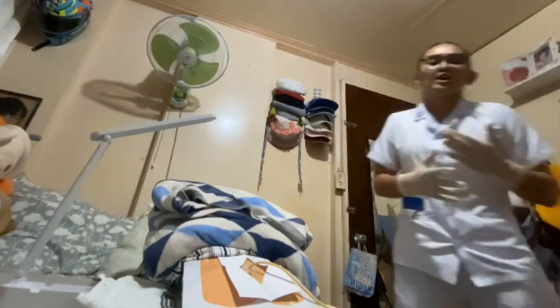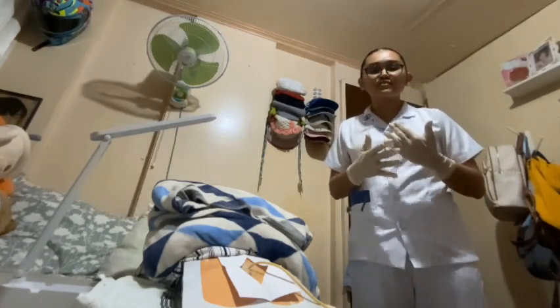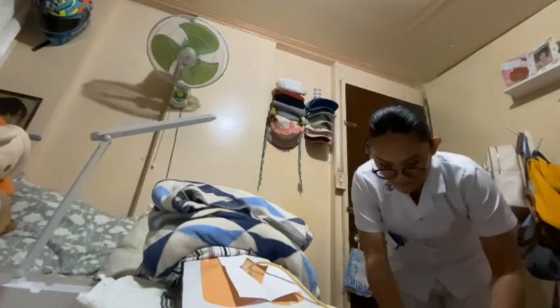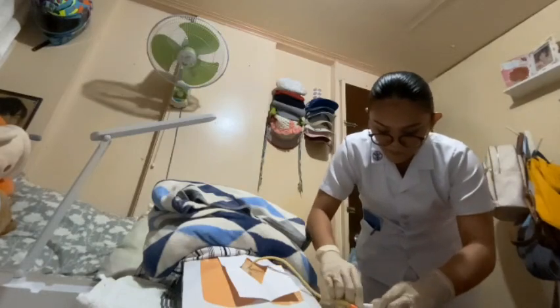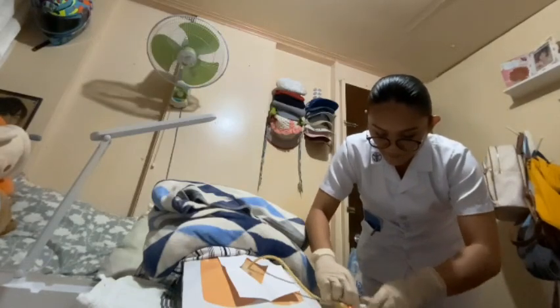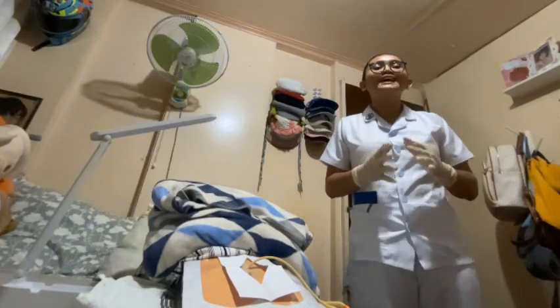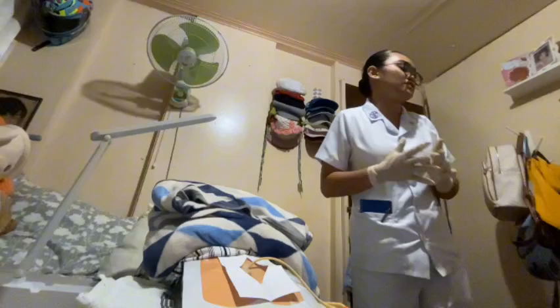Next is to connect the catheter to the urine bag, making sure no tubing falls below the top of the bag to prevent backflow of urine and reduce risk of infection. Then I will wipe away any remaining antiseptic or lubricant from the perineal area so that the patient remains clean and comfortable.